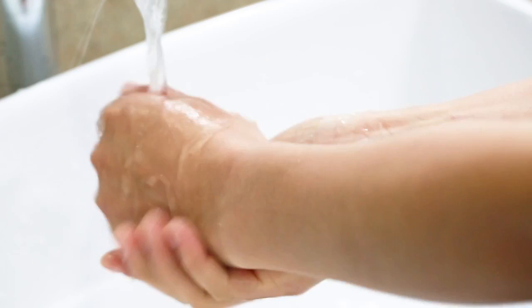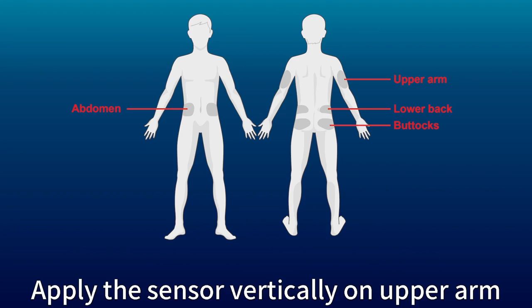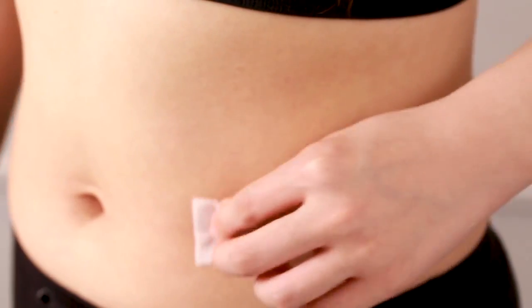Wash your hands with soap and water and wait until they dry. Now choose a flat and pinchable placement site. Clean it with an alcohol wipe and let it air dry completely.